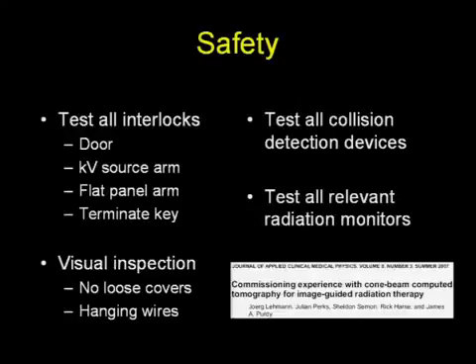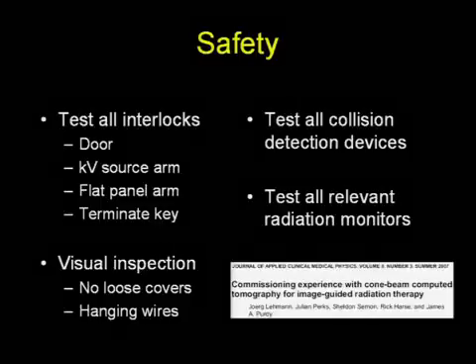And again, these interlocks not only address the touch guards, or the collision detection devices, but also: are the door interlocks working? Is the kV source arm deployment interlock working properly? The flat panel arm deployment, and test again that the terminate key is working properly.